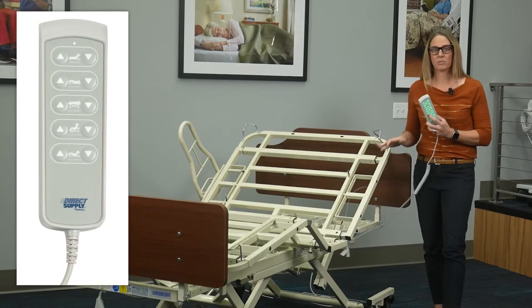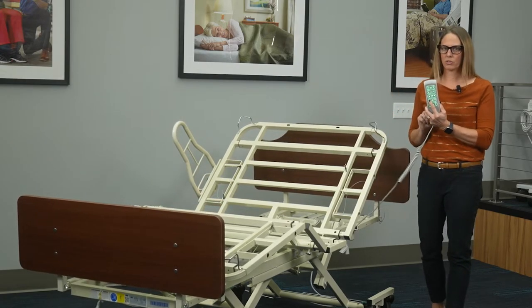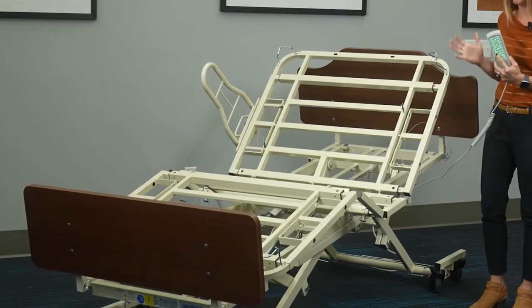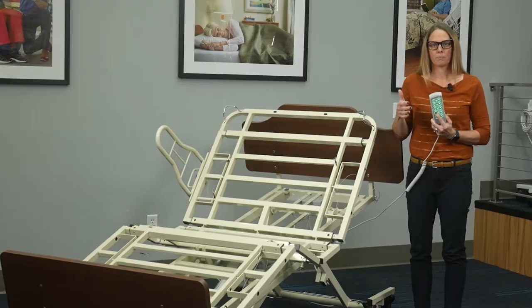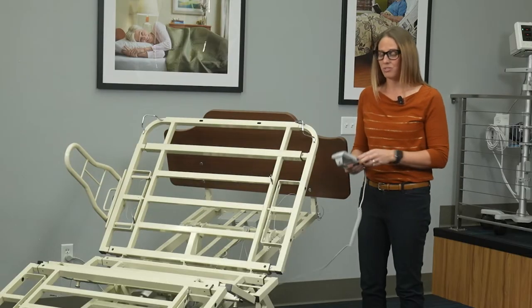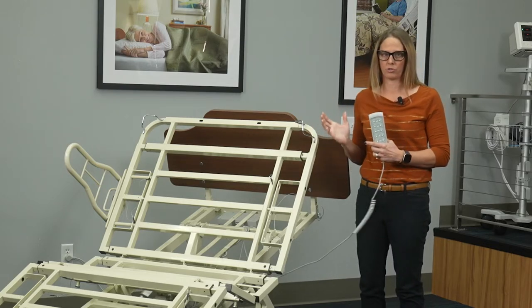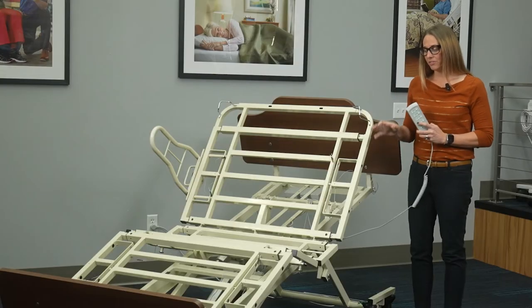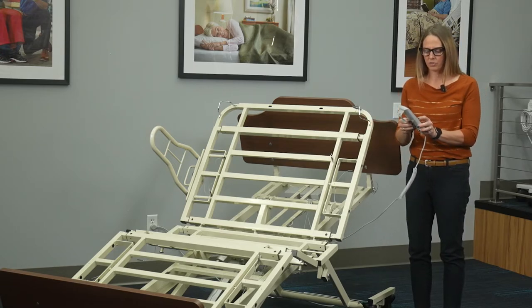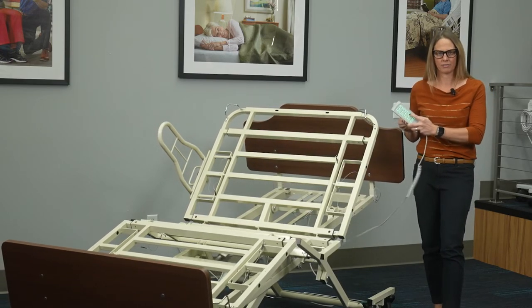In addition, it also comes standard with the chair function button. If I want to put my resident in a chair position, I just press and hold the chair button — it's going to drop the foot section of the bed and raise the head to give the resident a more comfortable position to eat or watch TV, where their hips and shoulders can be aligned. This is really important for residents who are bed bound or spend a lot of time in bed, as it helps move where the pressure sits all day. A built-in safety feature of this position is that the knees are locked automatically, and the only way to exit is to press the chair down button, which brings the bed back to level and safely releases the knees.